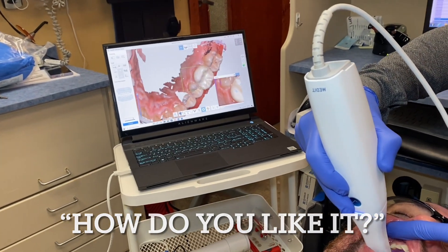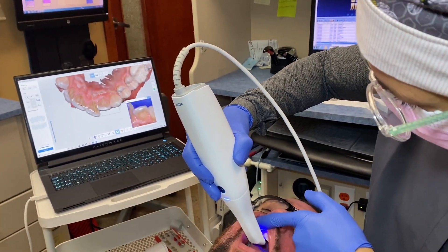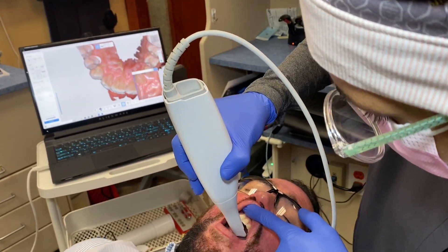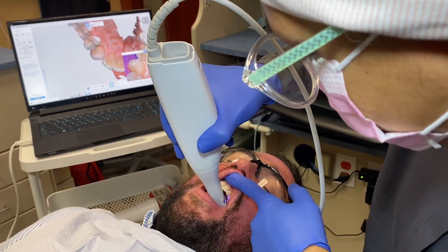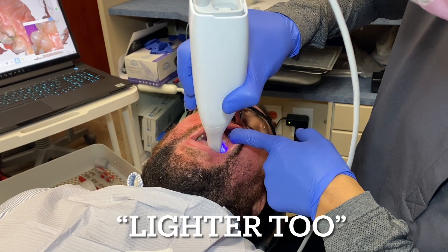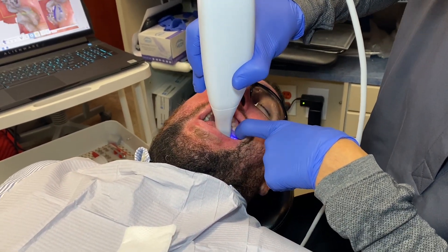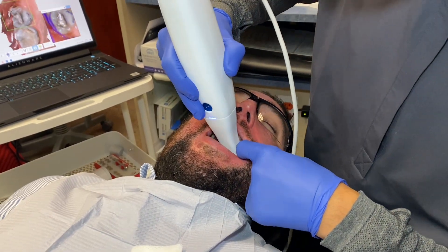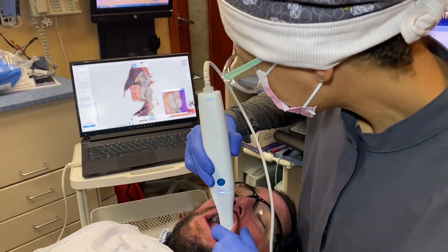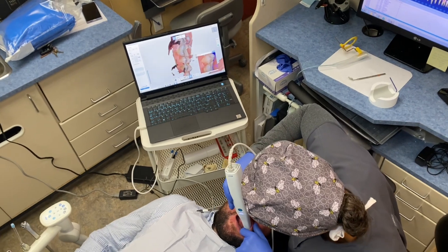How do you like it? So much nicer. I find it takes in more information faster. It's lighter too. Did you notice that? Quite a bit lighter. Now this is a very candid discussion, so no rehearsal here. We're talking about the features and she's noticing how light it is and how it moves around quite easily.